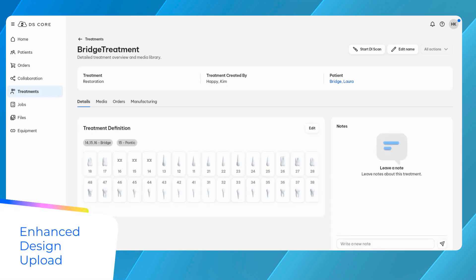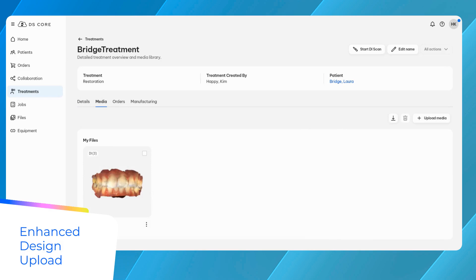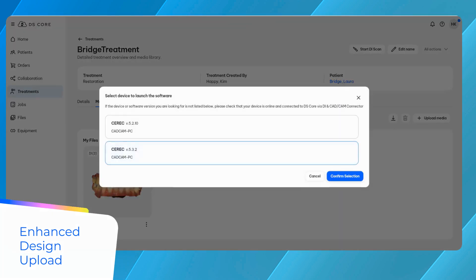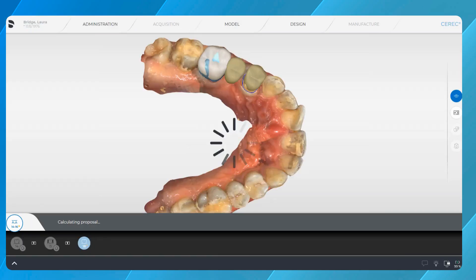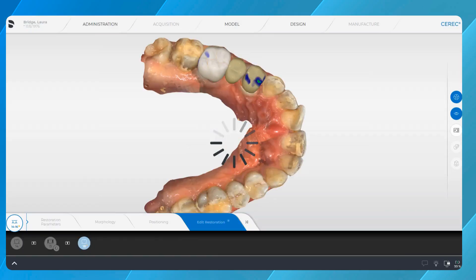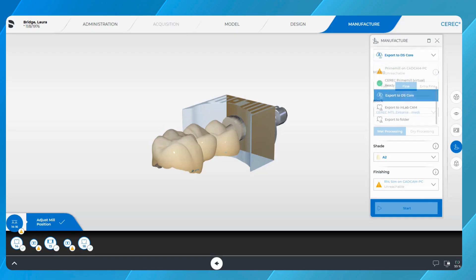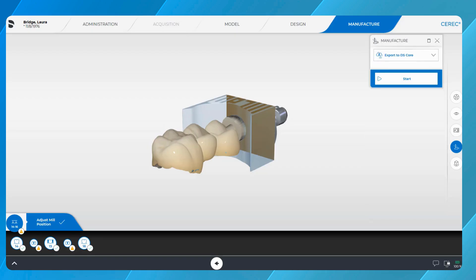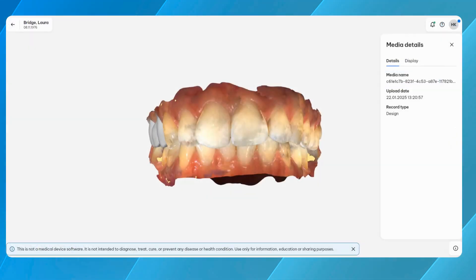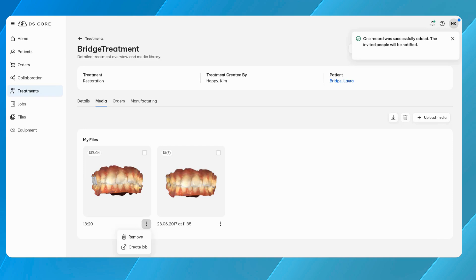With CEREC software version 5.3.2, users can now seamlessly save design bridge cases from CEREC to DS Core. Those design files include all necessary manufacturing information to start the milling job with CEREC Prime Mill from DS Core, freeing up the CEREC software for the next case. This streamlined process enhances efficiency and keeps the design software available for the next patient.